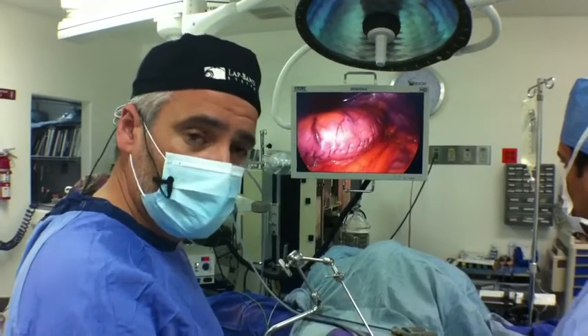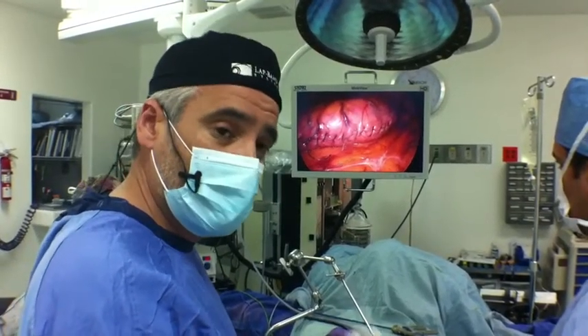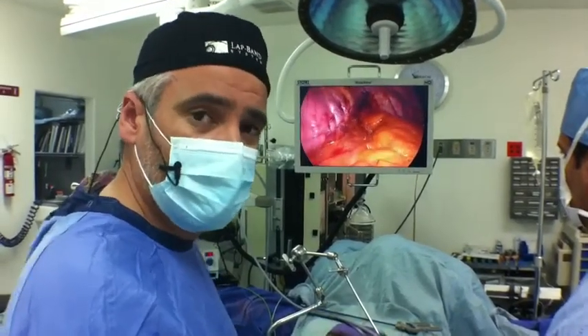We could not experience any of these complications, and we know for a fact that the herniations that happened in other cases and other patients were resulting from a different combination of stitching.